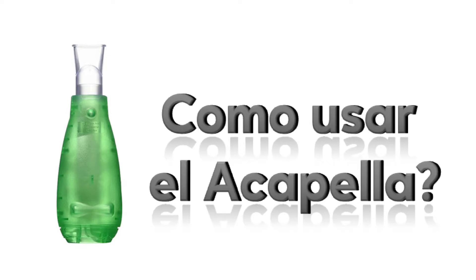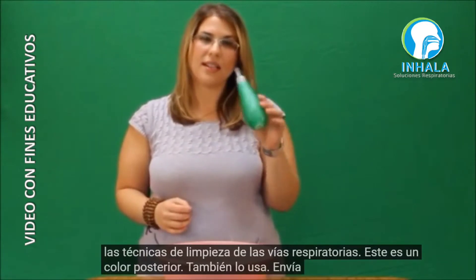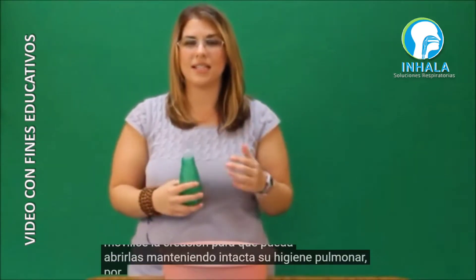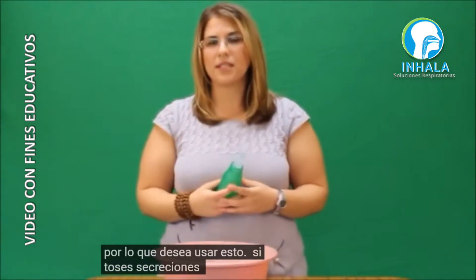Now we're going to move on to airway clearance techniques. This is an acapella. You use it to send vibrations down your airways to help mobilize secretions so you can cough them up, keeping your pulmonary hygiene intact. You want to use this if you're coughing up secretions daily.